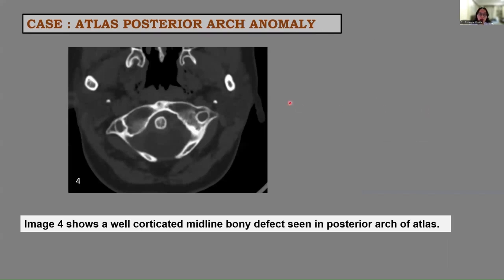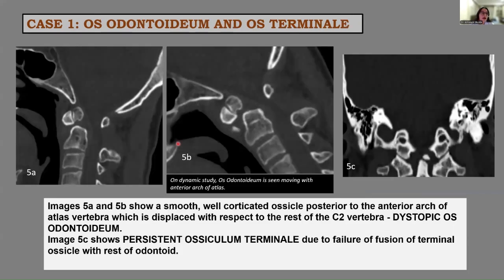Next is a case of atlas posterior arch anomaly, which shows a well-corticated midline bony defect seen in the posterior arch of atlas. Images 5A and 5B show a smooth, well-corticated ossicle posterior to the anterior arch of the atlas vertebra, displaced with respect to the rest of the C2 vertebra. On dynamic study, this ossicle was seen moving with the anterior arch of atlas, suggestive of dystopic os-odontoidium.